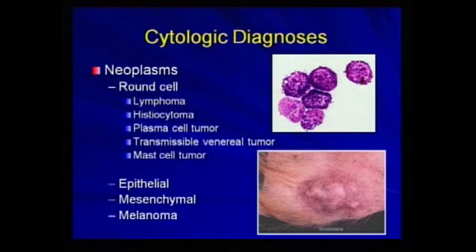So this is what we're going to look at over the next several hours. I would like to give you some general concepts and rules that will help you with these types of diagnosis. And we're going to finish the lecture with a number of case presentations.